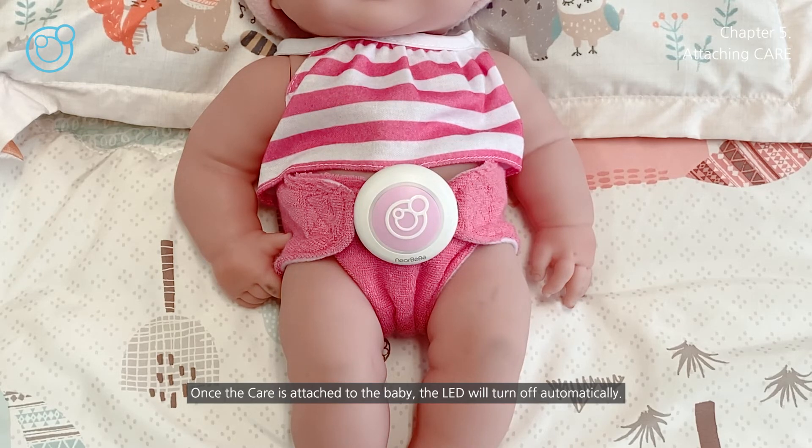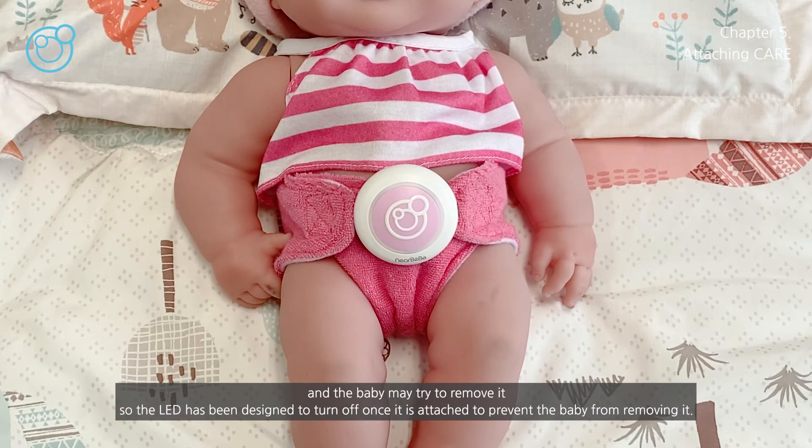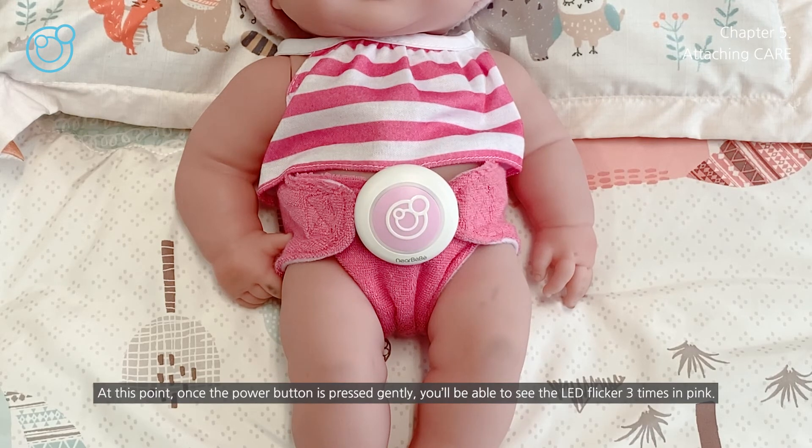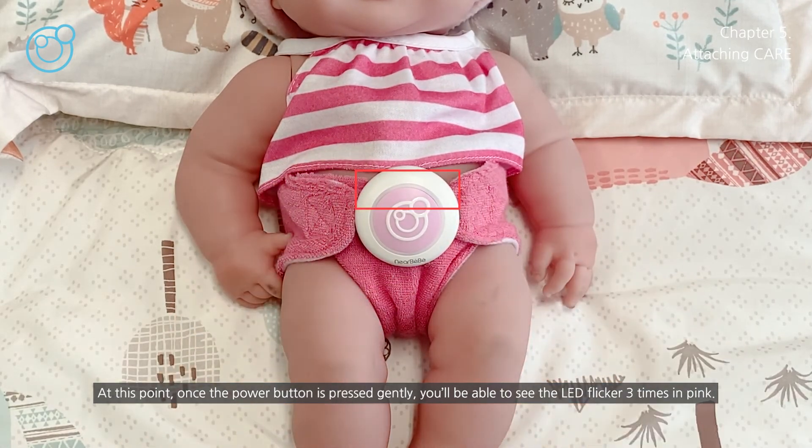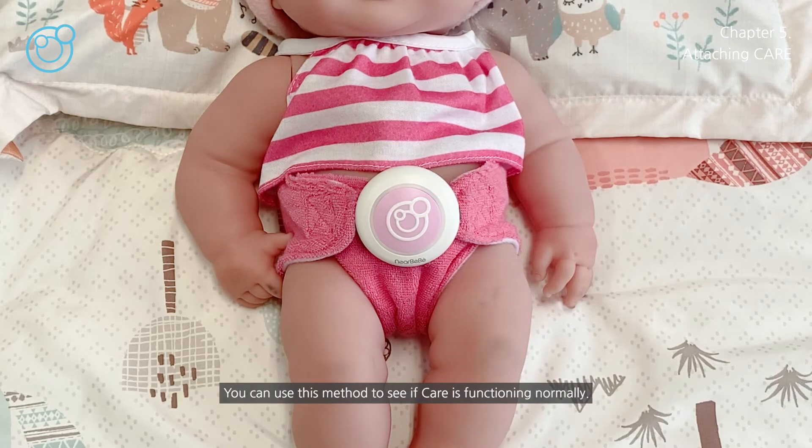Once the care is attached to the baby, the LED will turn off automatically. This is because if the light of care flickers, it will stimulate the curiosity of the baby, and the baby may try to remove it. So the LED has been designed to turn off once attached. Once the power button is pressed gently, you'll be able to see the LED flicker three times in pink — you can use this method to check if care is functioning normally.